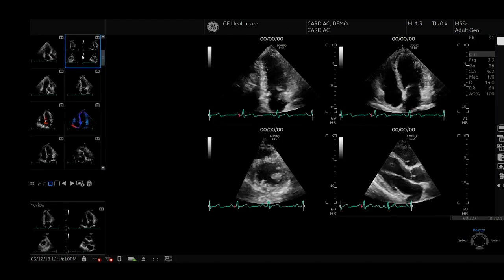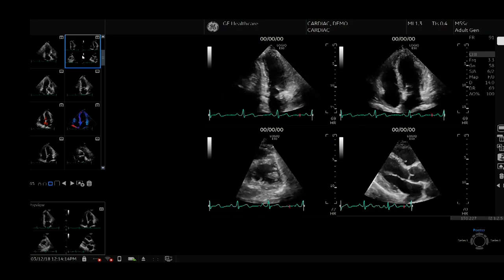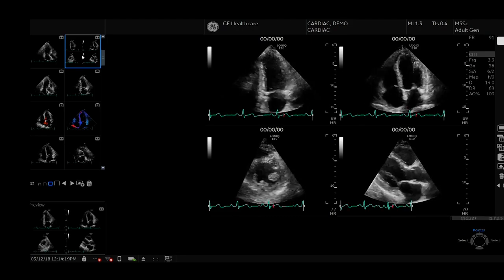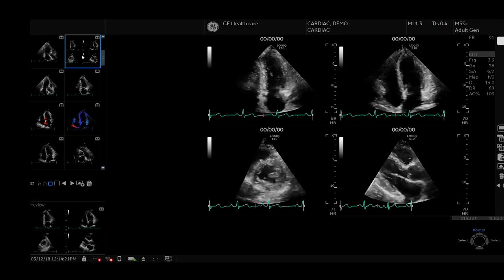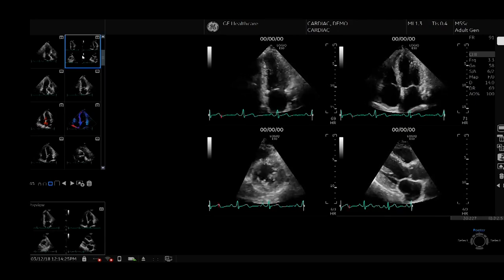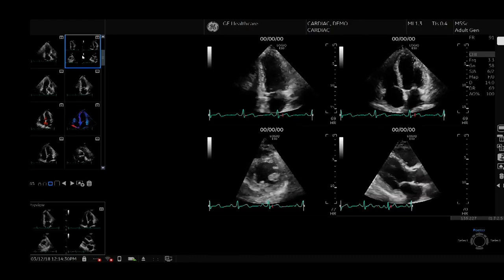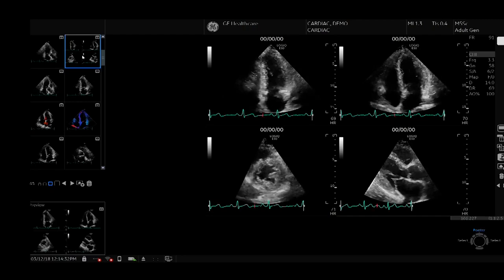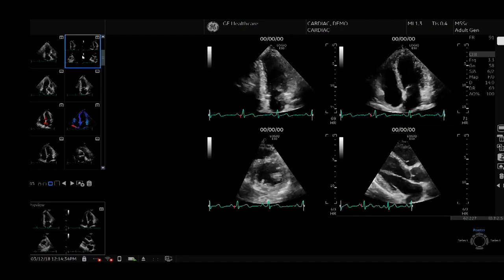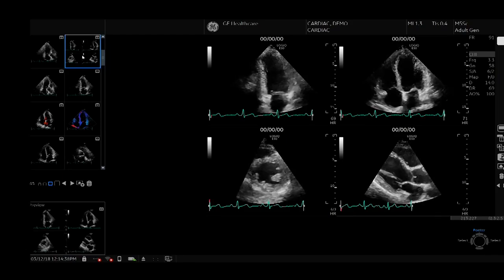Again, lengthy exam times can be a challenge in workflow efficiency in cardiac ultrasound imaging. The LOGIQ E10 can help shorten exam times to help you achieve concise workflow efficiency in cardiac ultrasound. One of our most powerful workflow features is raw data. The LOGIQ E10 now captures twice the data and helps shorten study times by enabling image processing and quantification after the exam has been completed.